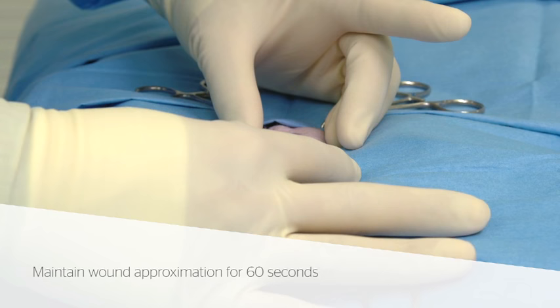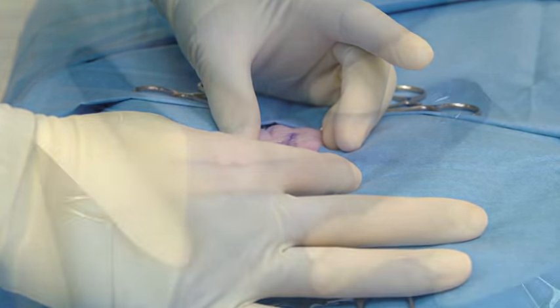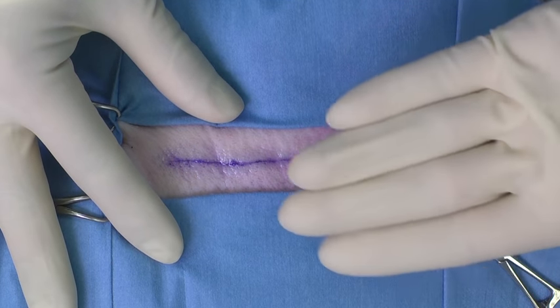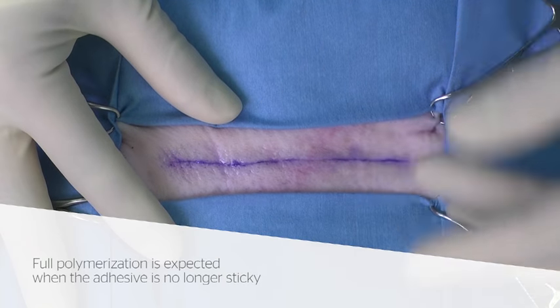Maintain manual approximation of the wound edges for approximately 60 seconds after application. Wait for the adhesive to dry, then check with a gloved finger for tackiness. Full polymerization is expected when the adhesive is no longer sticky.